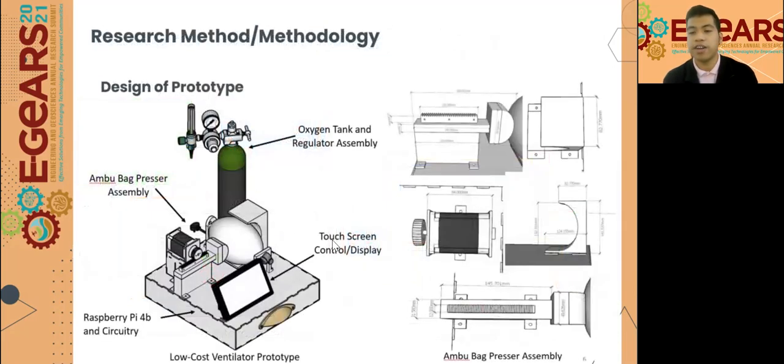Here is the whole design of the machine and the sizes of our supports, gear, and pinion, and the presser of the ambu bag.